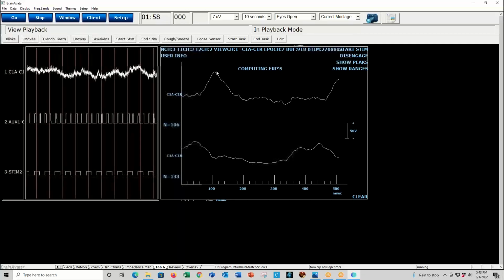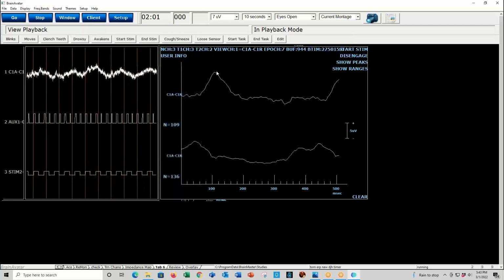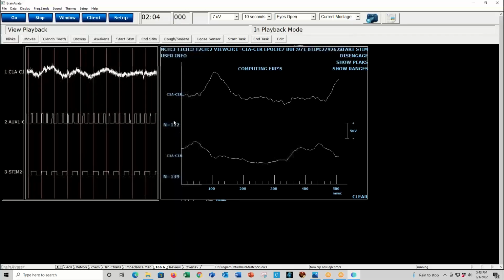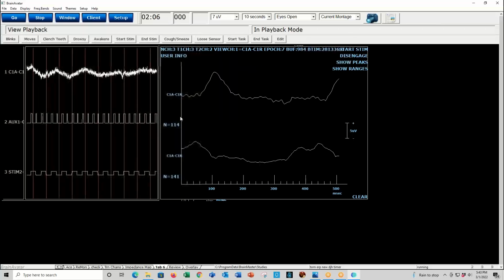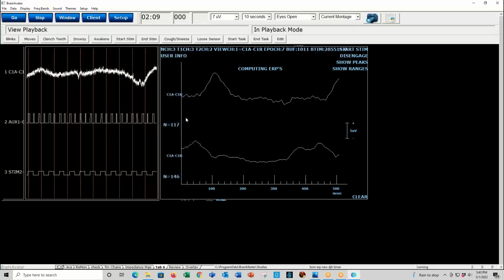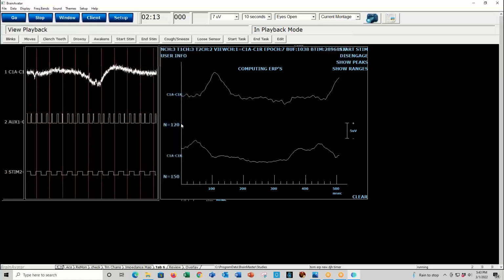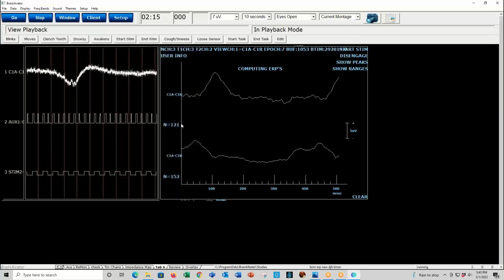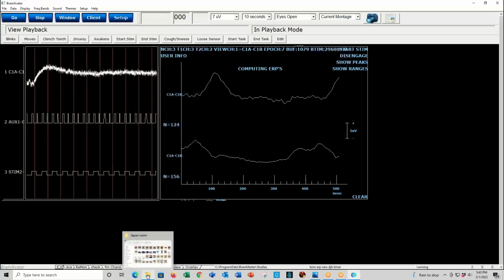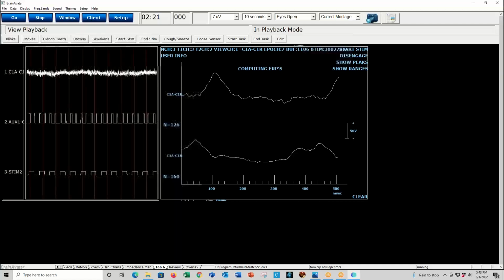And the data is also being written to the disk in Excel files for every average that's a multiple of a power of 2. So we're saving off averages for 8, 16, 32, 64, 128 responses. So it's being saved automatically. And for example, we'll let this run up around 128, and then we can go see the presence of the recorded data.